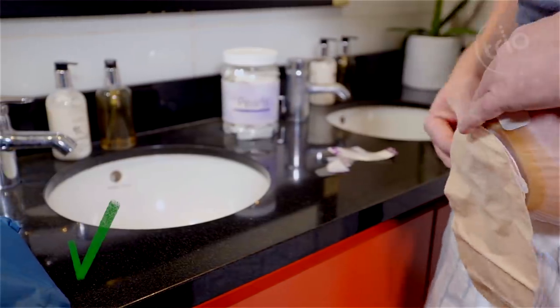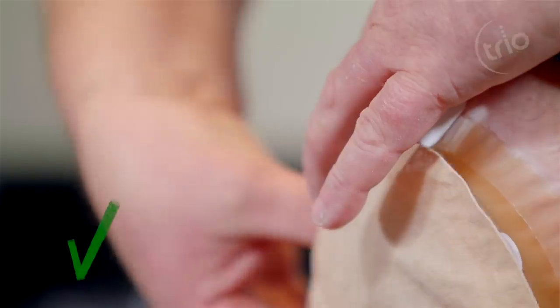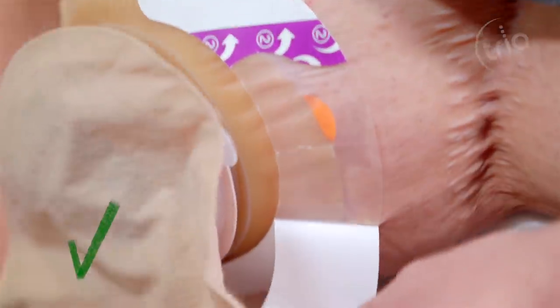You can do the same with a second extender. Trio Silics Flange Extender can be fixed in different positions to get the best results.